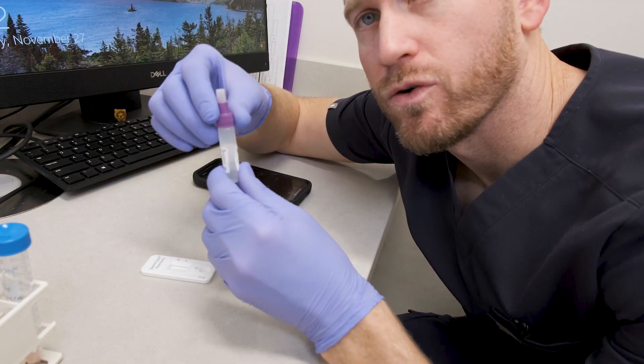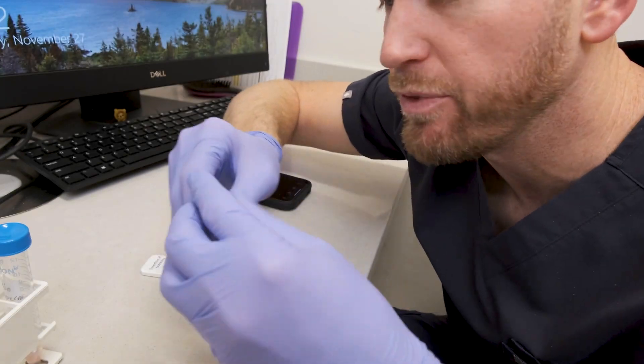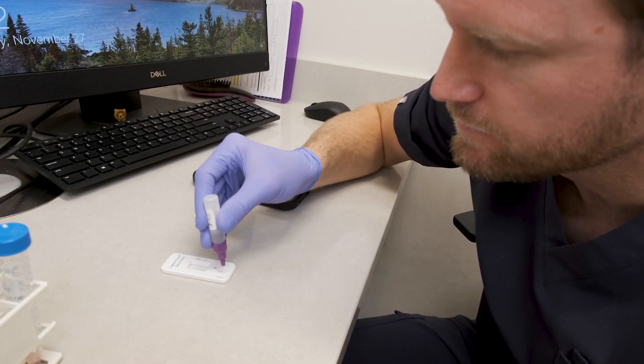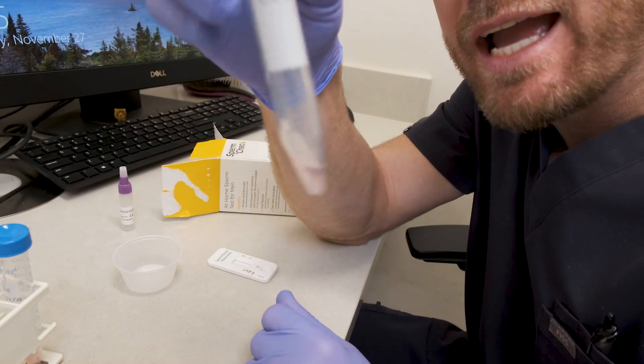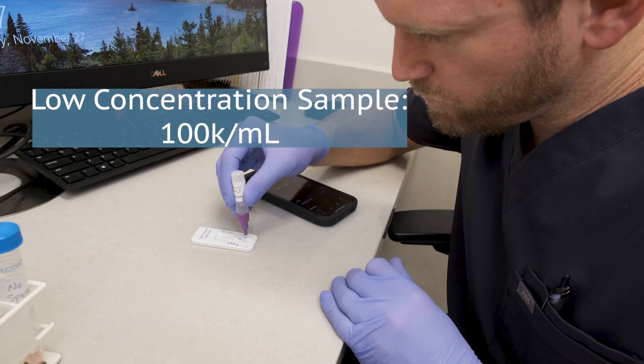Now let's do the negative control. I'm simply not adding any sperm — just their solution, five drops in there, no sperm. Now I'll do my low concentration sample. This one has about 100,000 sperm per milliliter.